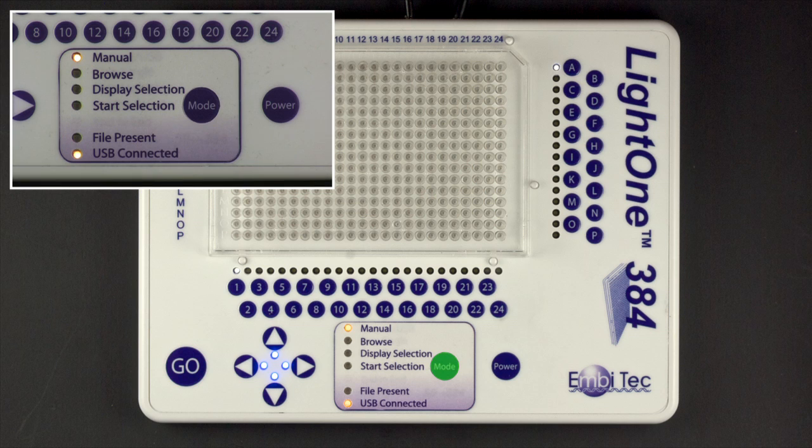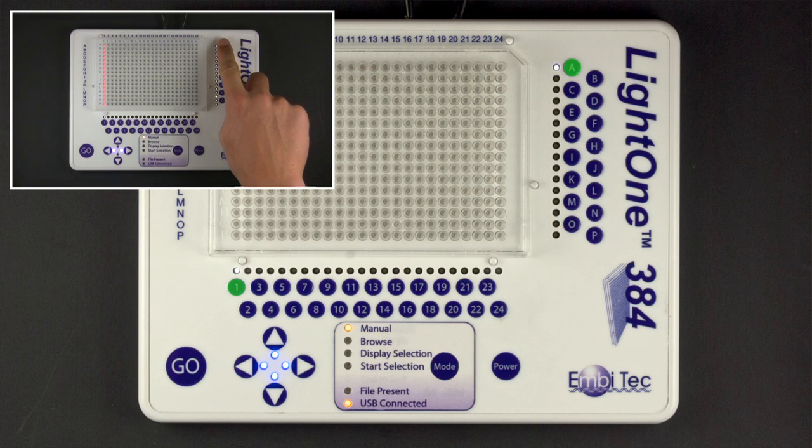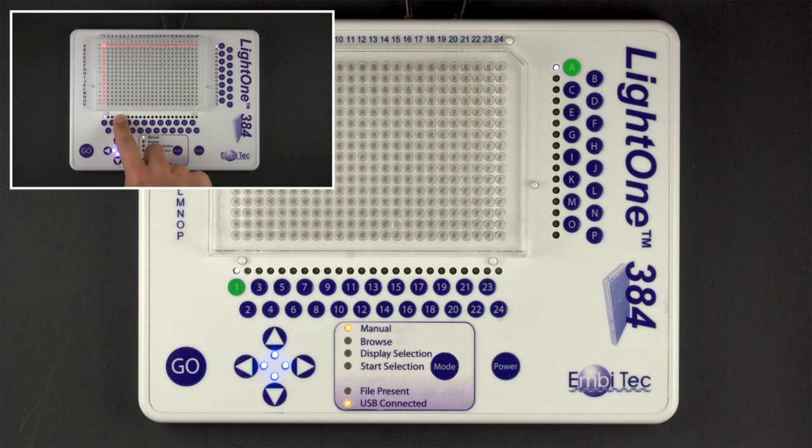The Mode button is used to switch between display options: Manual, Browse, and Start Selection. The left arrow switches to display selection while in Browse mode. The number and letter buttons, below and to the side of the main display area, are used to control the position of the selection in manual mode.